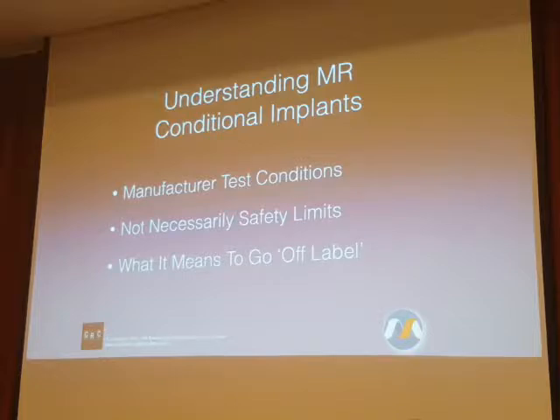Did it deflect 1 degree? Or did it deflect 44.9 degrees? We don't know. So I was working with this implant manufacturer. They had done the test many years before, and it had deflected 3 degrees. Their MR conditional label prior to me being involved with them was 720 Gauss per centimeter at 3T is okay.